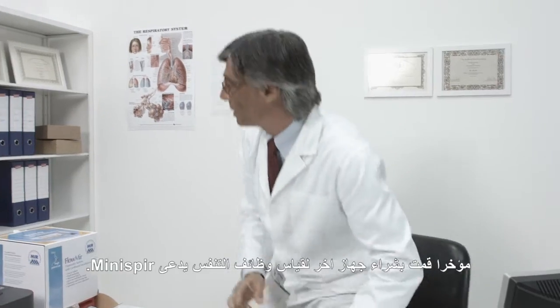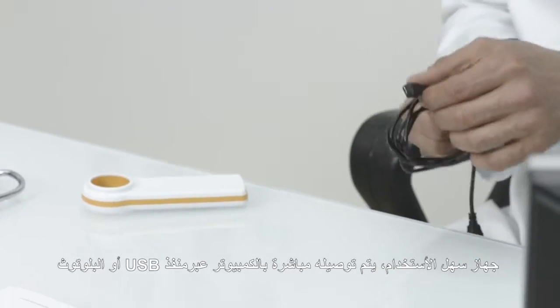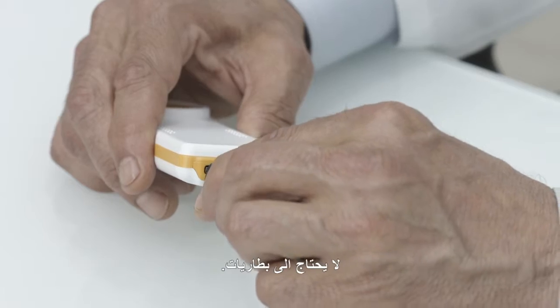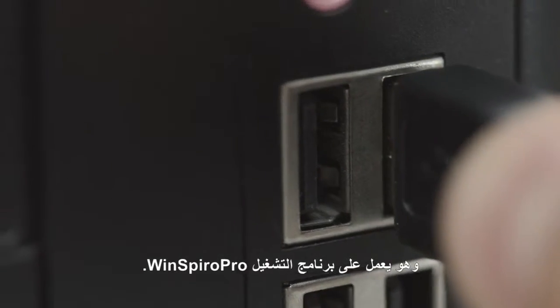Recently, I purchased another MIR spirometer called the Minispir. It's an easy-to-use spirometer which directly connects to a PC via USB. It doesn't require batteries. Also, Minispir works with WinSpiroPro PC software.